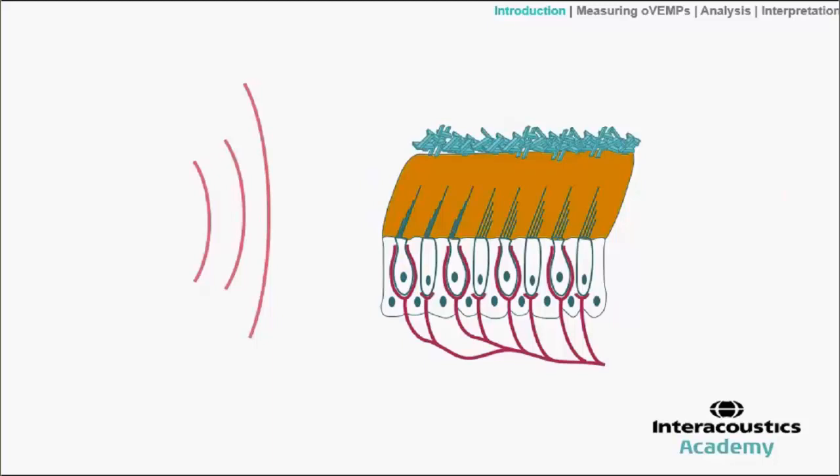It's important to note, though, of course, that those with a functional cochlea will hear the sound stimulus, and will also exhibit auditory evoked potentials too, but that's almost a side effect in this particular application.